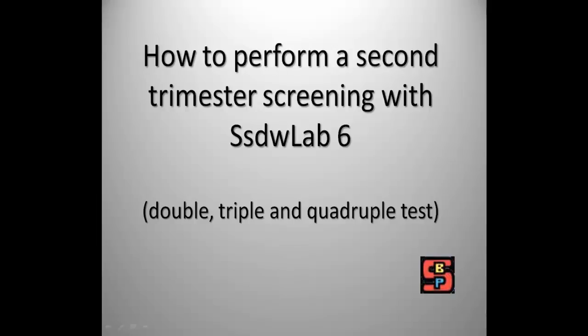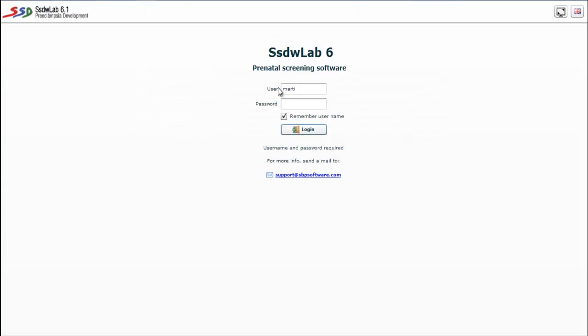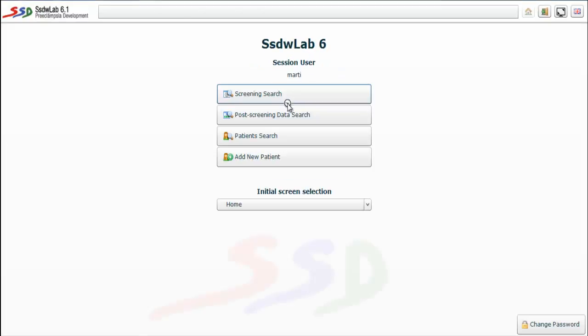Let's see how to perform a second trimester screening test with SSDWLAB6. We must enter the web program, so we should introduce our ID and password to log into the web.